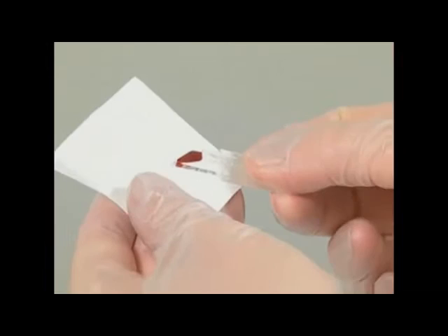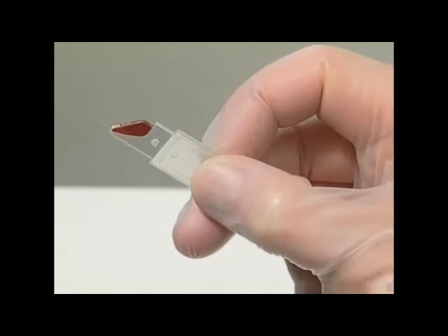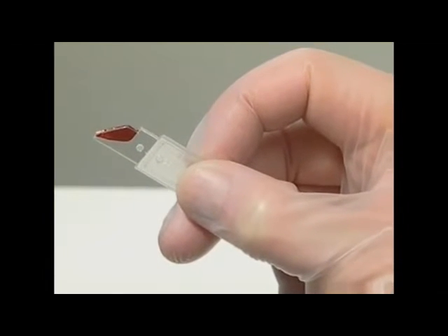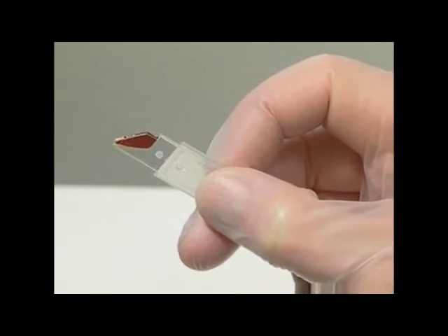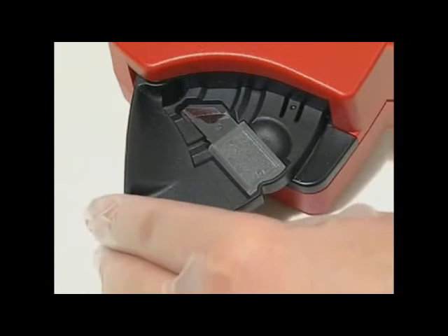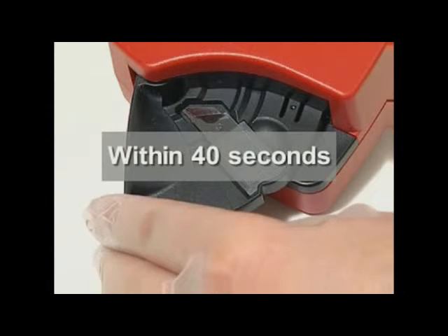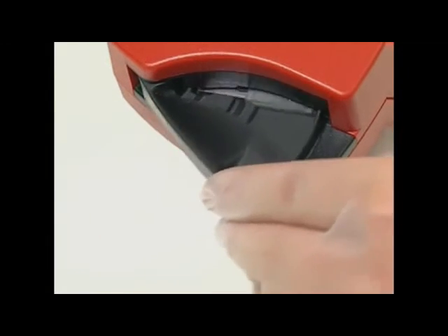Wipe off any excess blood from the outside of the micro cuvette tip, making sure that no blood is drawn out of the micro cuvette during this procedure. Look carefully for air bubbles in the filled micro cuvette; if any are present, discard the micro cuvette and take a new sample. Small bubbles around the edge can be ignored. Place the filled micro cuvette in the cuvette holder within 40 seconds after filling. Rotate the cuvette holder to its measuring position.